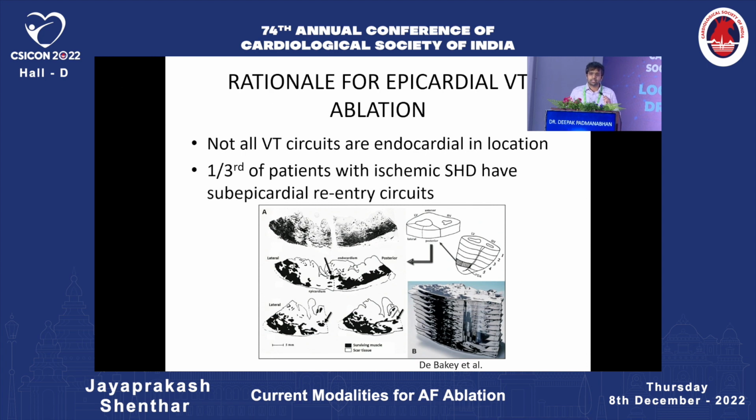So the rationale for why we should approach the epicardium of the heart is that initially, when ablation was described as a surgical technique, people were already utilizing the epicardium. But when endocardial ablation was done, it was the endocardium that was touched and the epicardium that was difficult to touch.